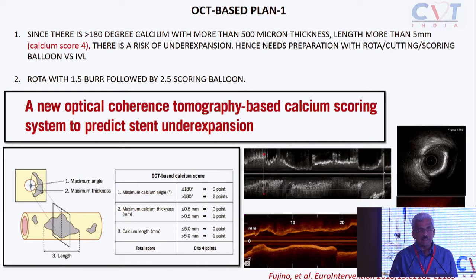Your distal diameter is 2. Your vessel tightest is about 1.3, 1.4. So my debulking device of choice will be a rotablator, which is 1.5. Then we could decide whether we need the next step. So this is how you think when you go in after imaging.